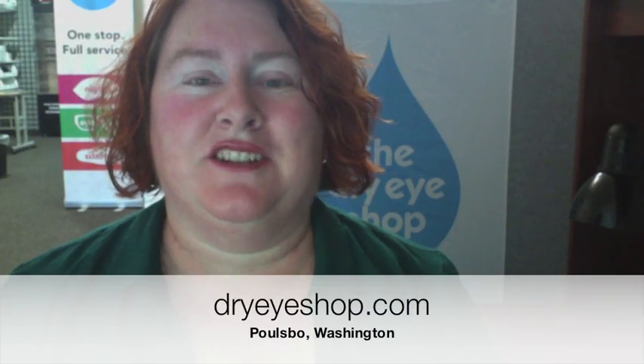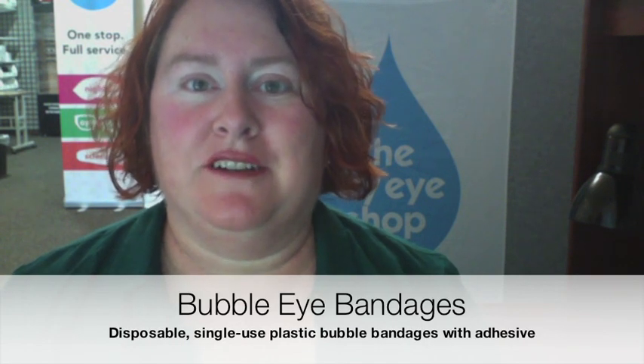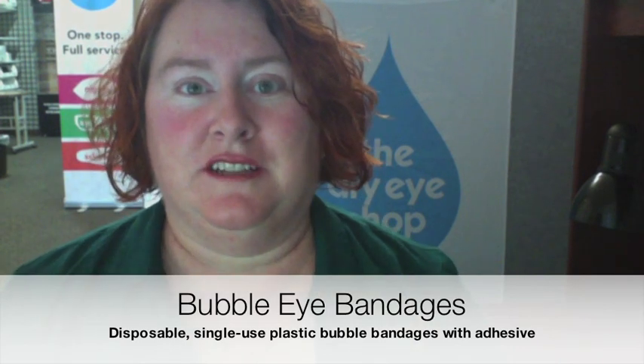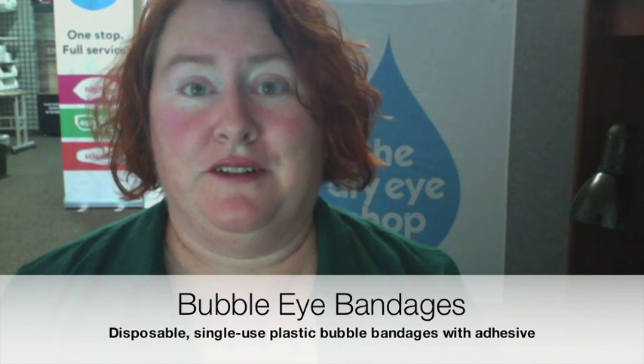Hi, I'm Rebecca at the Dry Eye Shop in Poulsbo, Washington, and we're going to take a really quick look at each of the disposable bubble eye bandage products. My skin is already pretty irritated because I just did this demo once but forgot to hit the record button. So here I go again.